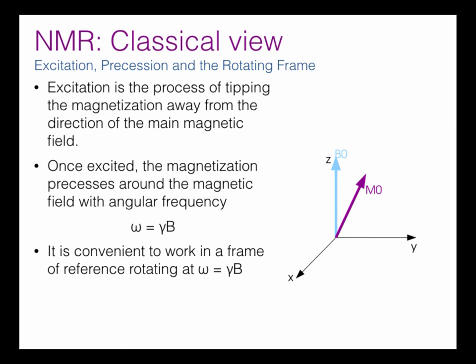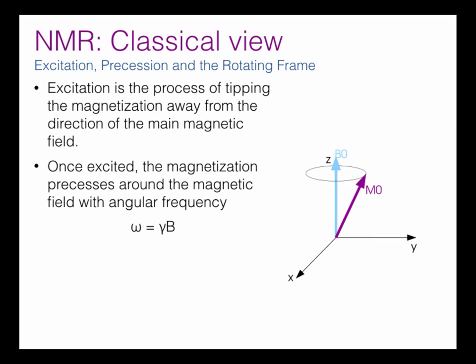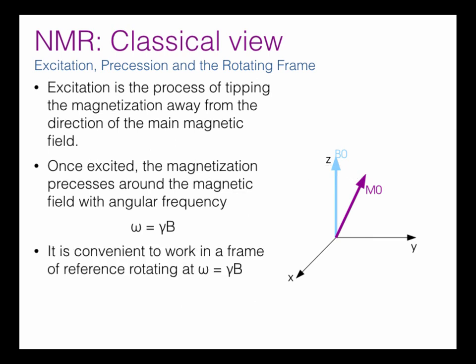And this is just one example. That would mean that this x and y are different from the x and y in the previous slide, because that is the lab frame, and this would be in the rotating frame. So this x and y are spinning with respect to the magnet, and the z direction stays the same, of course, because it's still along the bore of the magnet.